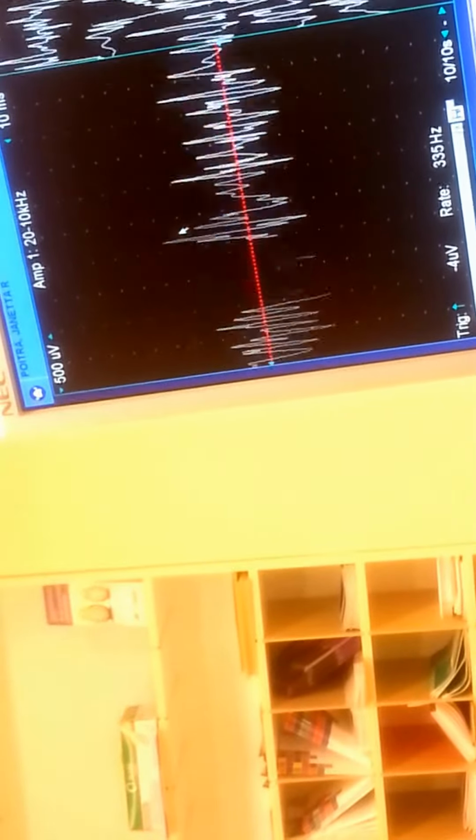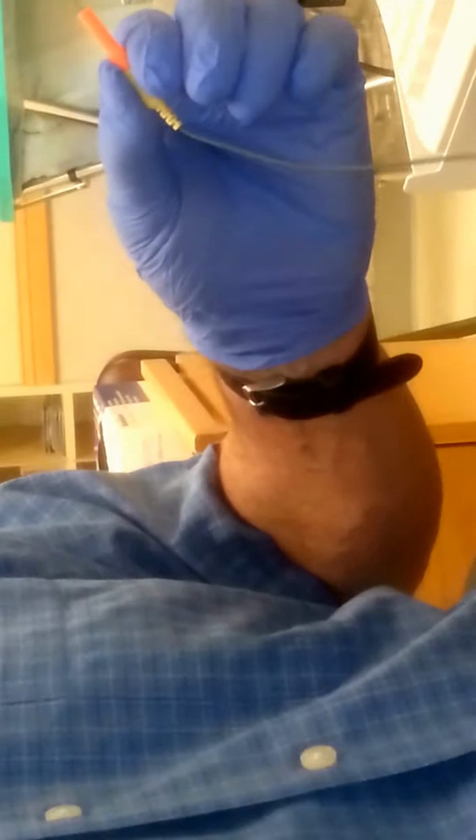Push up hard. See how you generate strength? That's pretty good. Push up again. That's electrical strength, and those are motor units, and they're all sharp and skinny. That's what they should look like, not wide and jagged. So far the nerve supply all the way down to there is good. Now we're into the hand area. So yeah, there's always a drop of blood or so, but not too bad.